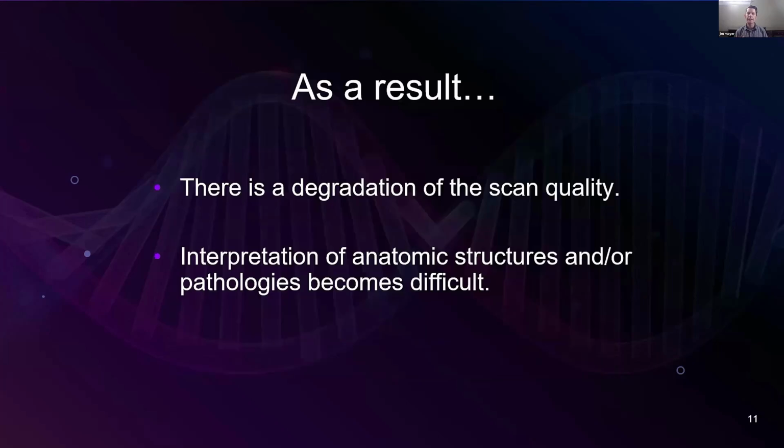The staff can also look at the data right after they've scanned. The patient is still there, and if we did see movement, then we can rescan them. I know most, really all, state and province requirements say you're supposed to be able to see the patient as you're scanning, so you can evaluate if the patient is moving or not.